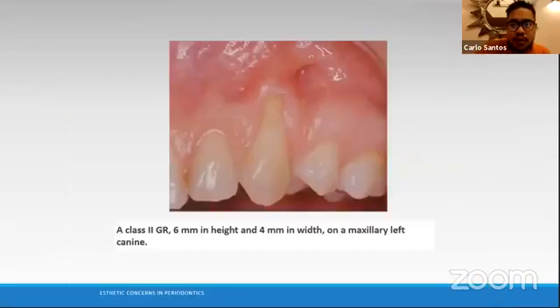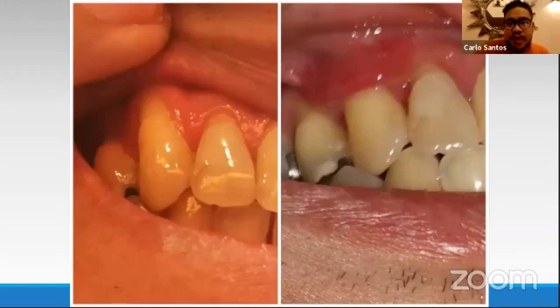Oh, sorry, this is 3 weeks post-operatively. So you can see attachment occurred. I think we haven't seen the patient since then, but with this state, the patient was very happy. And again, I want to reiterate: this was done the first time by our participants. So if they can do it, I am pretty sure everyone can do it.